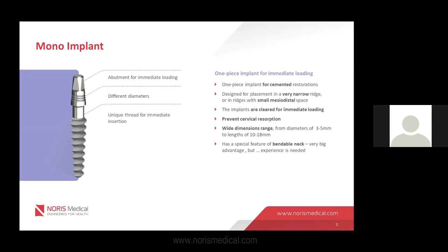Noris has a very wide dimension range of the implant, from 3 to 5 millimeters in width, and lengths ranging from 10 to 18 millimeters. By the way, this happened with all the companies, because those implants started as very narrow implants that worked only for the mandibular incisors, narrow ridges, and lateral incisors in the upper jaw. But with time, clinicians and implant companies understood that this implant is used not only for narrow cases.